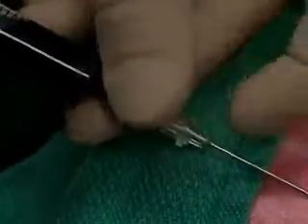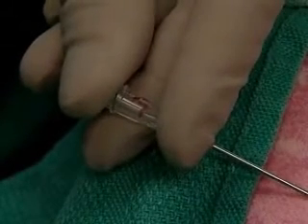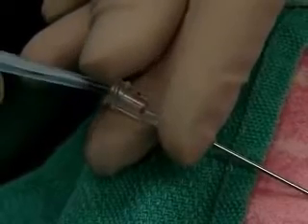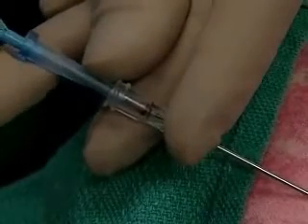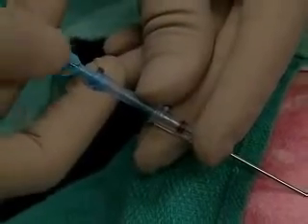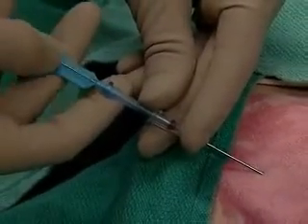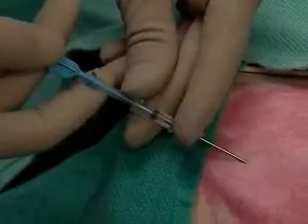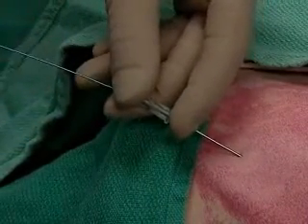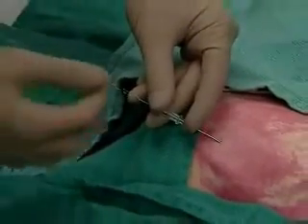Hold the needle securely, remove the syringe, and start feeding the wire. That 20 centimeter mark disappears into the needle and we'll go just past that point. You see the wire exposed. Hold the wire as you carefully remove the needle.